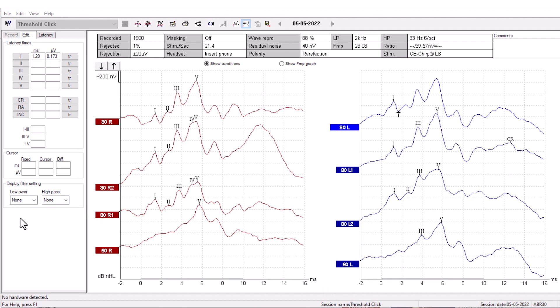At the bottom of the Edit tab, you can change the display filter settings. This will not affect the raw data of the recording, and you can always disable the filters again. This function can help remove any unwanted noise in the recording, which can make the measurement easier to interpret.